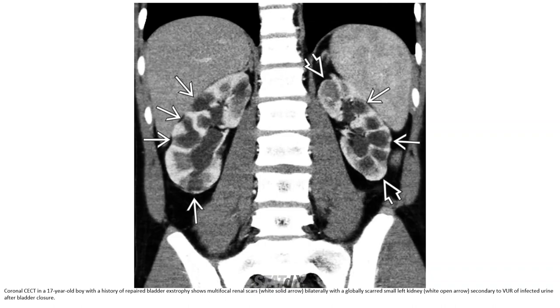Contrast-enhanced CT in a 17-year-old with a history of bladder exstrophy shows multifocal renal scarring with a globally scarred small left kidney, secondary to VUR and infection during and after bladder closure.